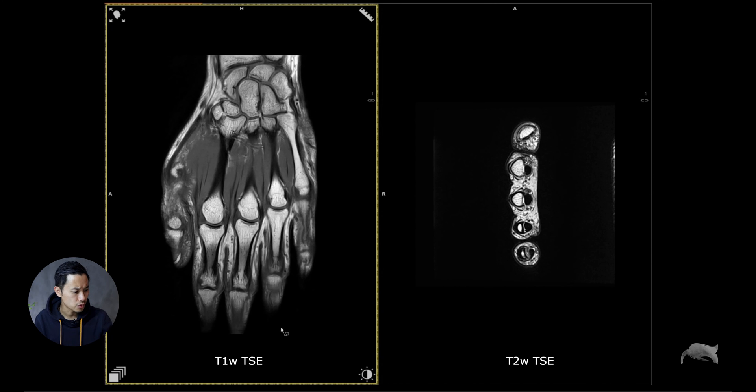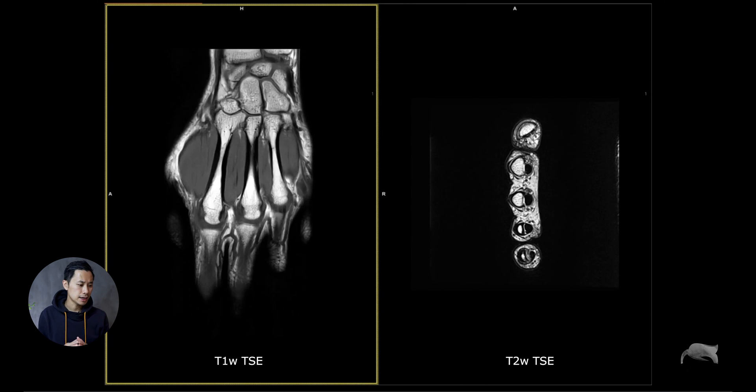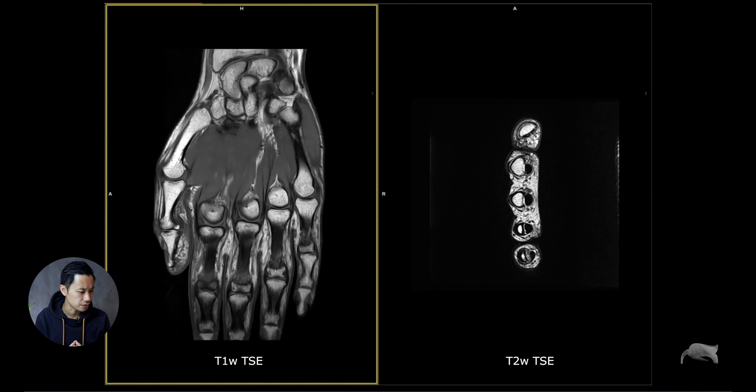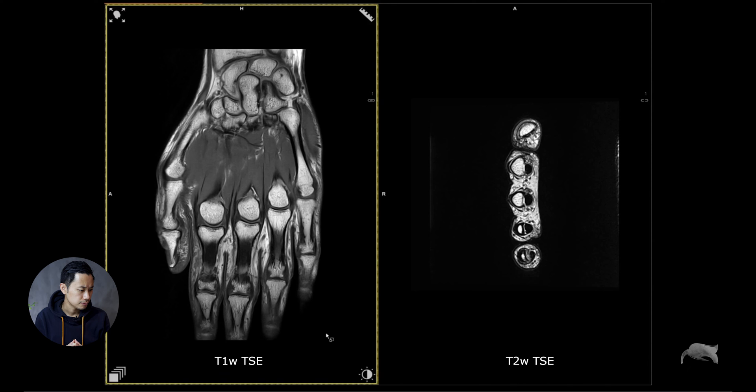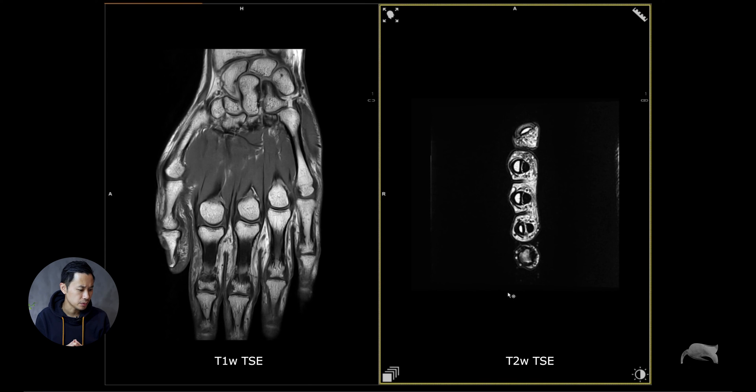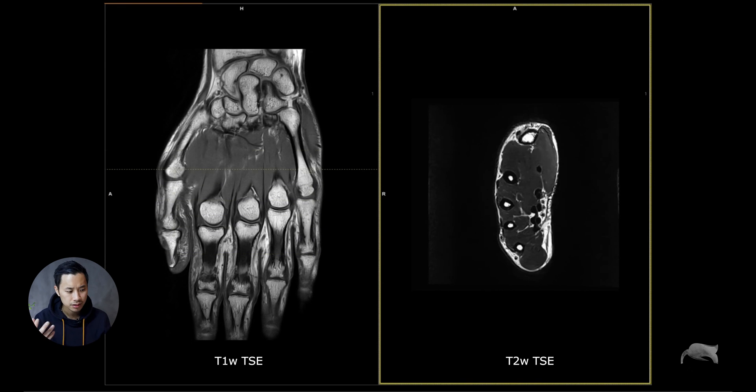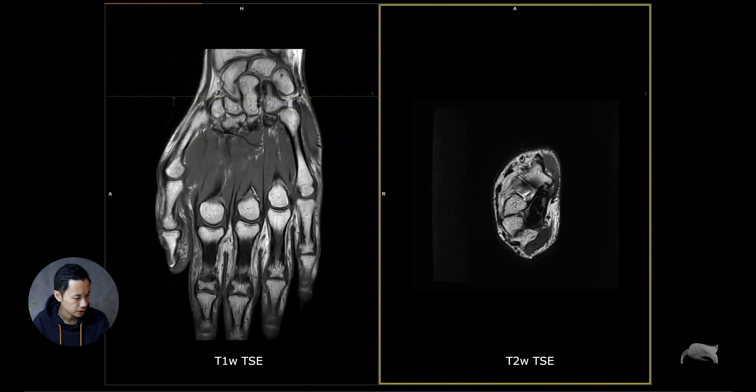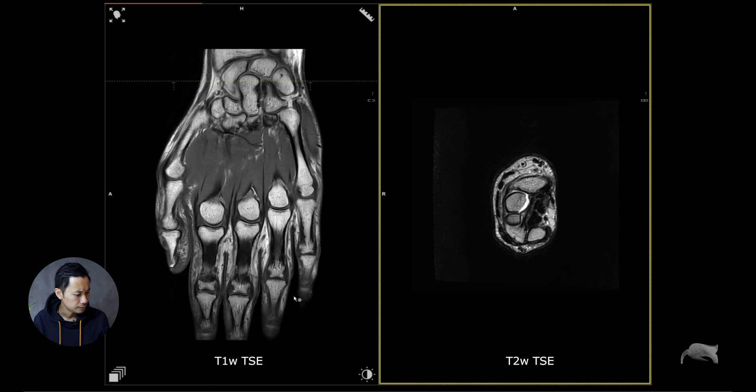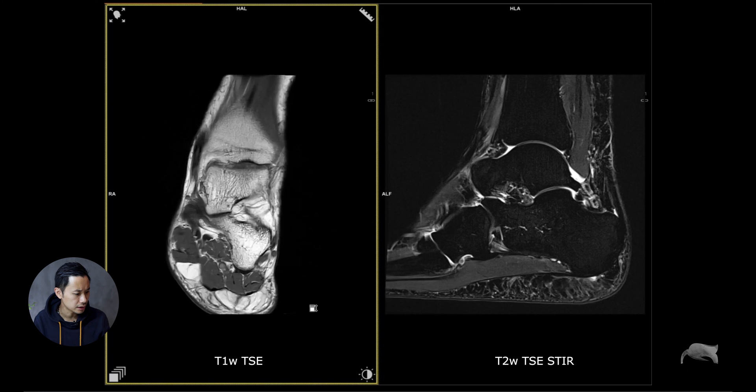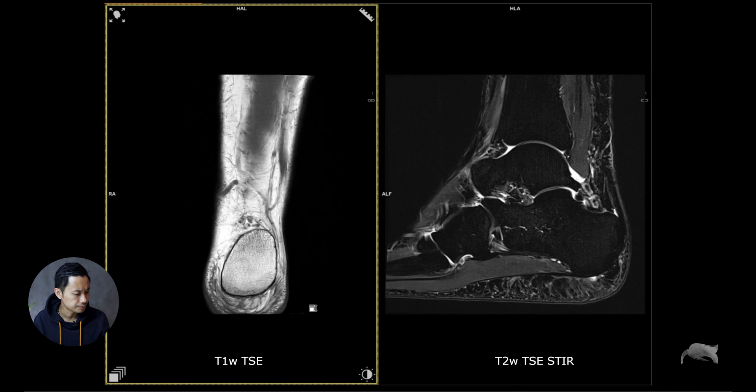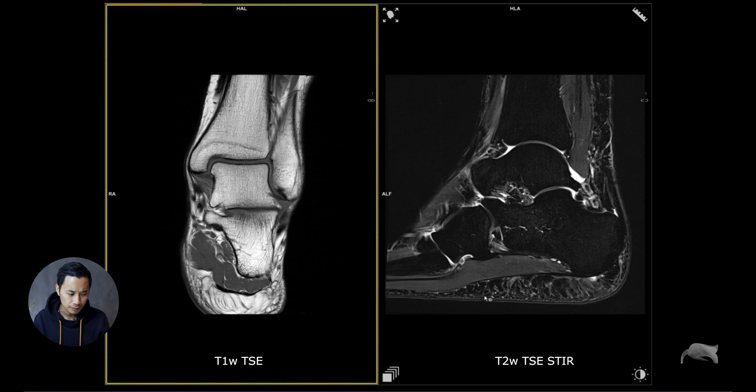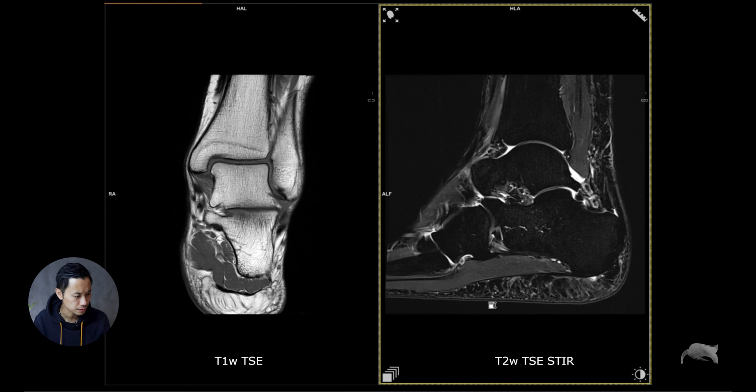You can see the ligament and the TMJ is sharp, just like that. And of course the hand wrist images like this was T1 and then you get a T2, that transversal scan less than one minute or so. It's just fast with the Deep Resolve Boost on. Then we move further down to the foot ankle. You can see T1 and T2 where the STIR is also applied with the Deep Resolve Boost, so it makes things faster.